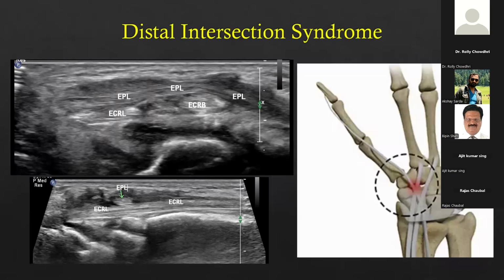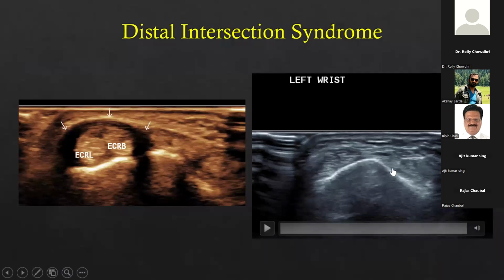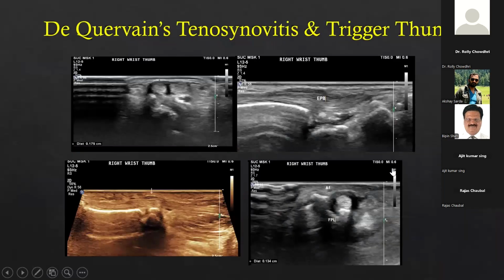So this is present more towards the dorsal side and close to the thumb. The proximal intersection is a little more cranial in the distal forearm, but the findings are the same. Now, if we have one pathology, it is not necessary that we may not have another pathology.